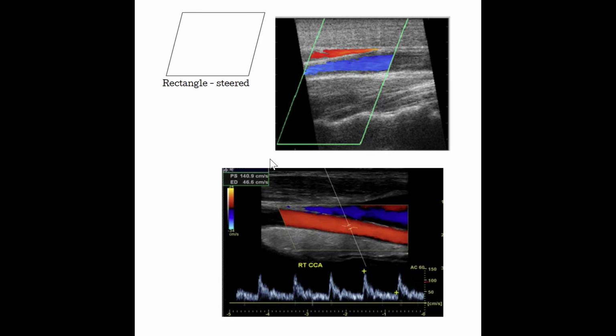So the crystals that are making the B mode picture are still using sequencing behind. So all the black and white are sequenced crystals going across the transducer face, making the black and white image. The crystals then that are being used to make the color Doppler and the pulsed Doppler are going to undergo phasing. So those sloped patterns, those small groups of crystals, are going to undergo that phased sloped pattern to create the steered beam that we see in the color portion.